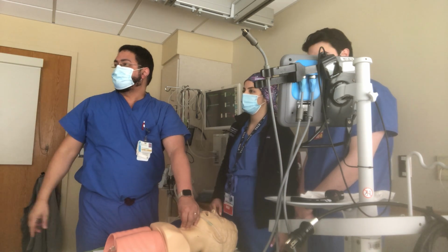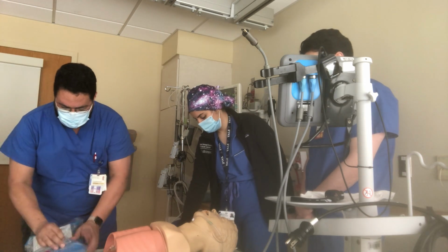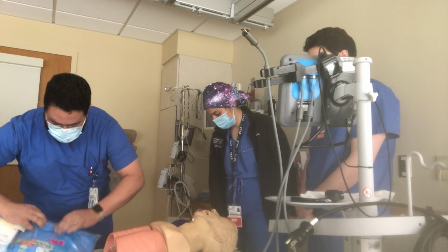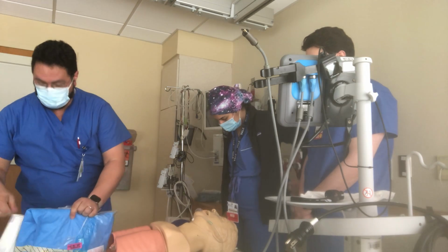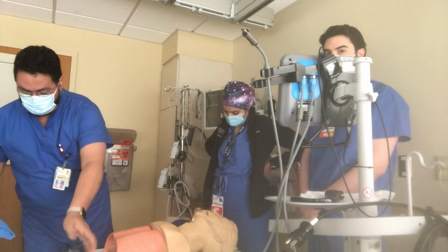This one? All the way. No, yeah, this one. That one. Right? So there's something in the cric kit. It's called the tracheal ring crusher. And I'm not joking. It's called the tracheal ring crusher. It actually crushes the tracheal rings.